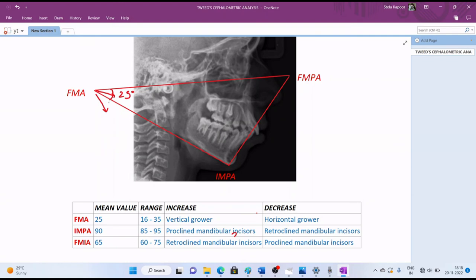Second angle is IMPA, indicating the position of the incisor on the mandibular plane. The average value is 90 degrees with the range from 85 to 95. Any increase in this angle will indicate a proclined mandibular incisor, while a decrease in this value would indicate a retroclined one.